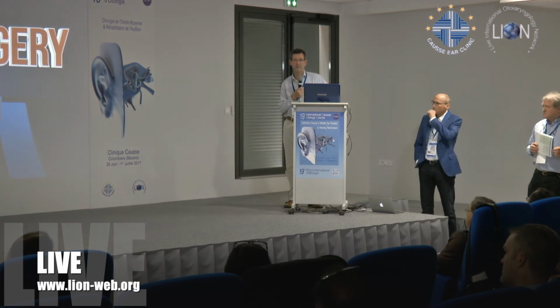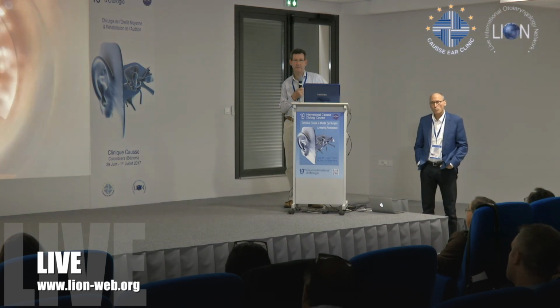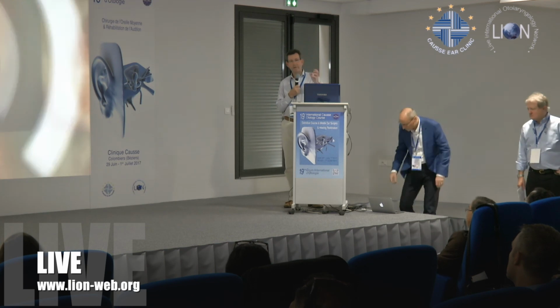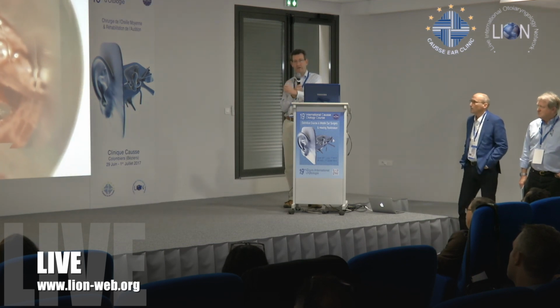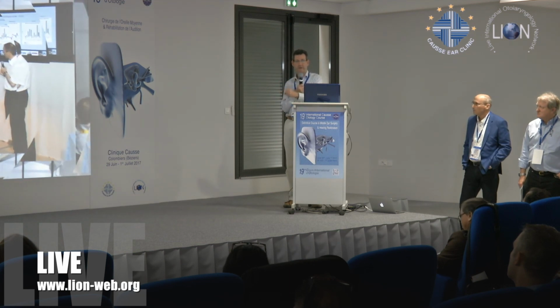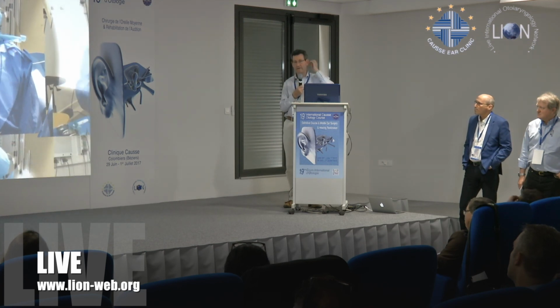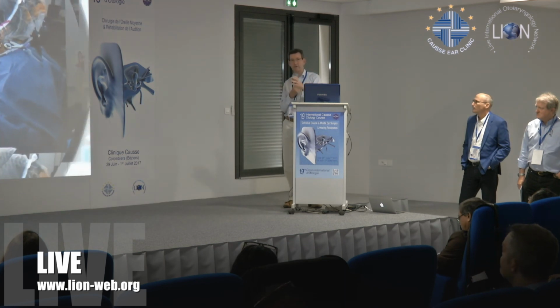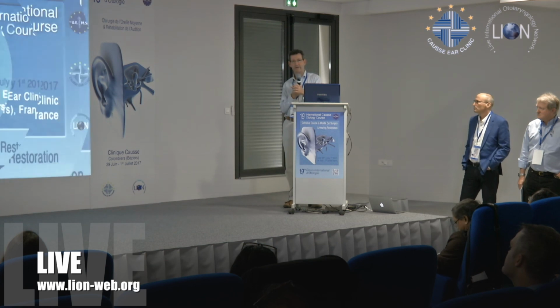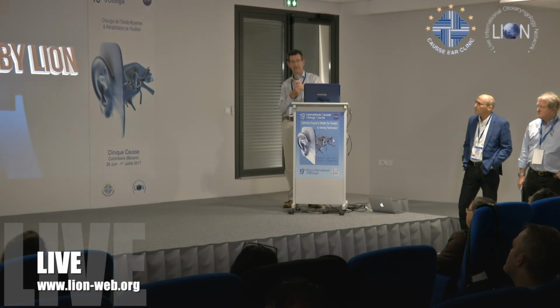I think you see a little bit more early skin and soft tissue reaction if you examine the patients in the early course with the HA coating. And then that kind of quiets down and goes away and hopefully will prevent some of that overgrowth that you were showing. Yeah, in theory, and Cochlear and I think in Sweden and elsewhere, they've done animal studies showing tissue integration to that Dermalock hydroxylapatite coating. It may be real, but I'm not so sure. You get such skin movement that there's going to be some shearing forces around the abutment, and it's unclear to what extent it's a coating, and to what extent it's just having a non-reactive interface where you can get some skin keratin or skin ingrowth so that it remains clear.